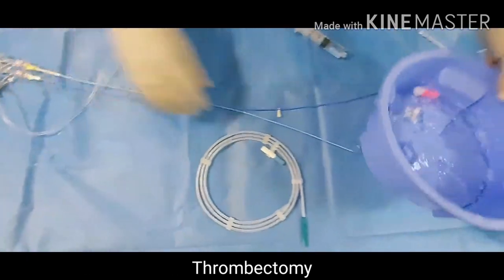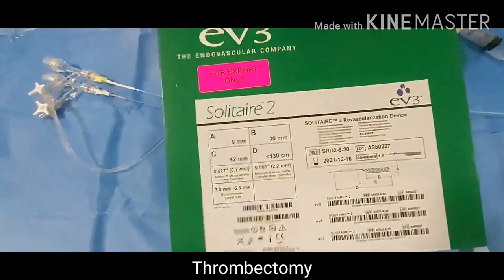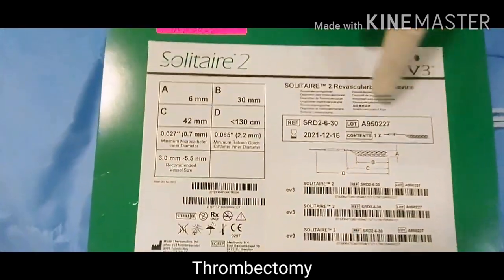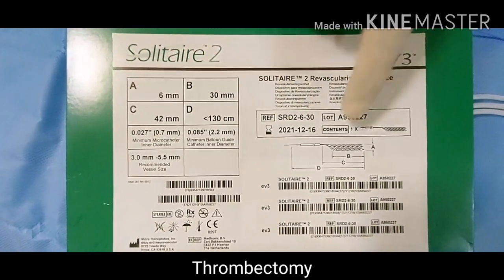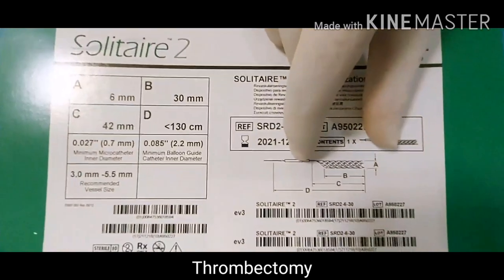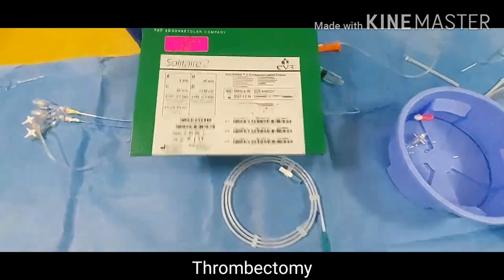Now everything is ready. The revascularization device we are using here is the Solitaire. Depending on the size of the clot, we will use different sizes of the revascularization device. This is the Solitaire — it is a filter type, it can catch the thrombus. It is very costly so we are not opening this one, just demonstrating.